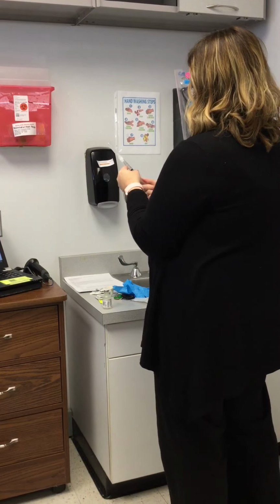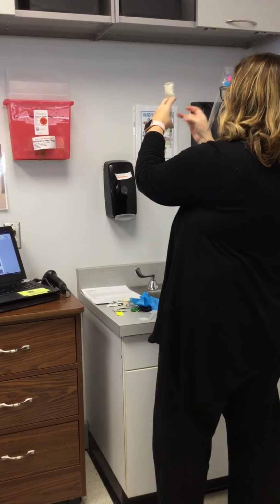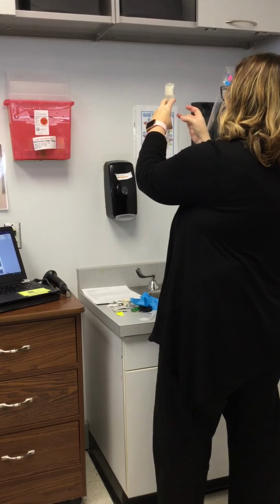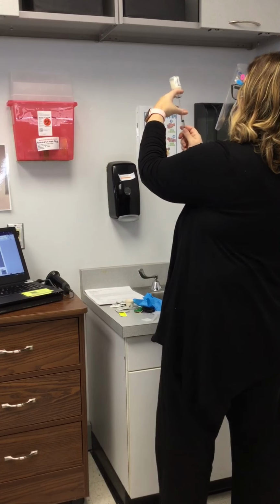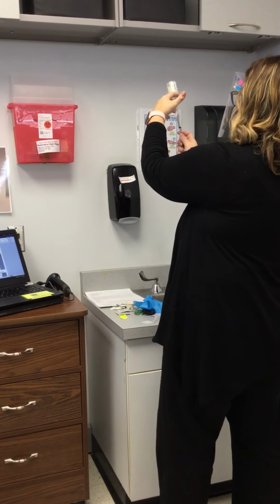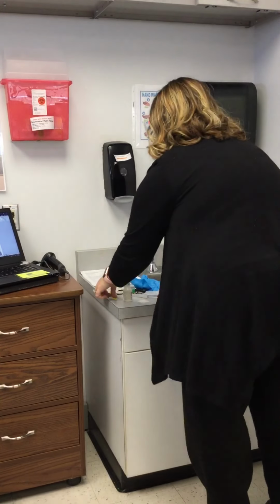and draw up my medication, making sure that I get all my bubbles out. Make sure when you're drawing up that you stay below the level of the solution so you don't get air. And then I'm going to scoop my cap back on.